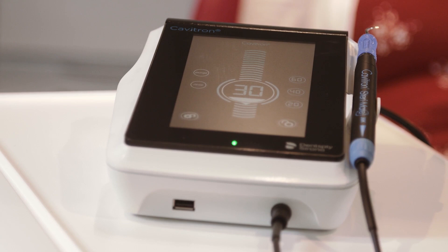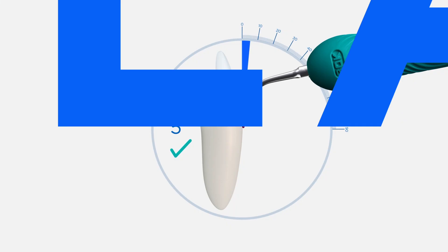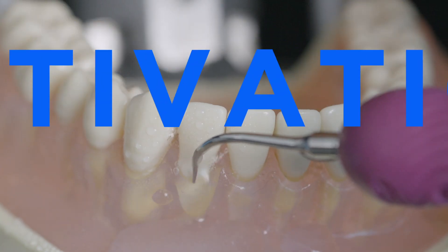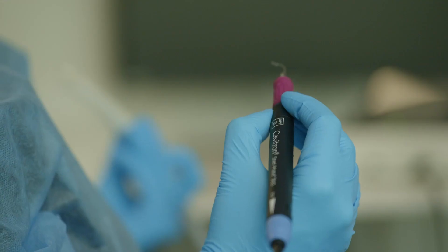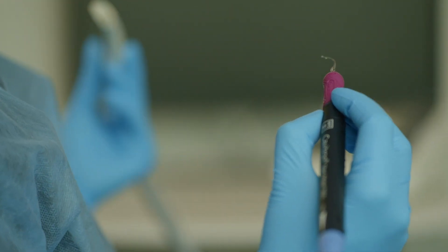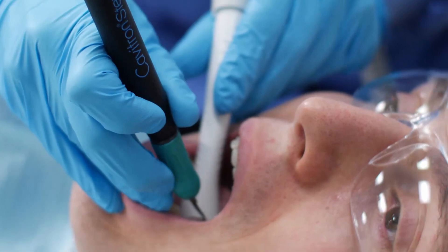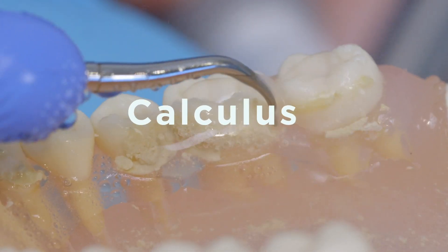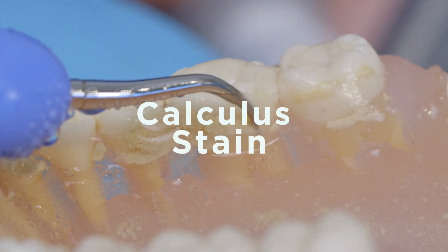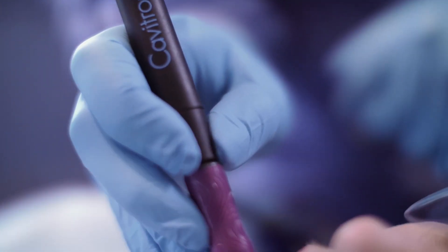Combining Cavitron scaling systems with ideal adaptation, angulation, and activation during ultrasonic instrumentation may lead to a comfortable patient experience while maximizing disruption and removal of biofilm, calculus, and stain for effective and efficient clinical outcomes.